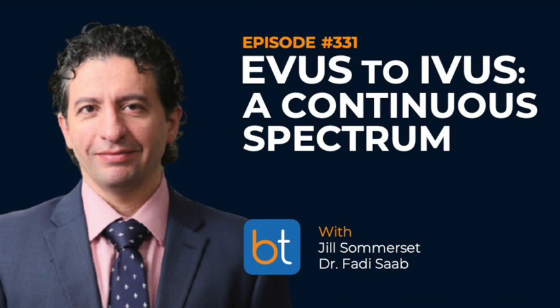So, let me ask you this: would you even comprehend performing stenting in May-Turner syndrome without the use of intravascular ultrasound? Would you agree? Who would not use intravascular ultrasound right now for May-Turner? I've taken the IVUS machine in my car to hospitals to do May-Turner cases because I know they don't have it there. That's how strongly I feel about it. So we're on the same page.